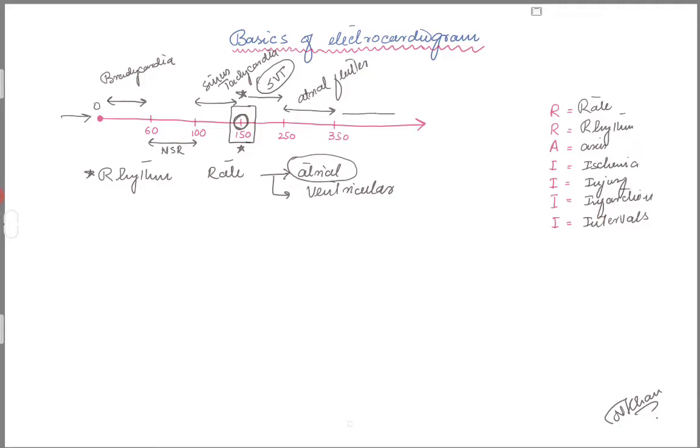Above 350, can go up to 500, is your atrial fibrillation. Again, we're talking about the atrial rates. This makes it very easy to look at the EKG.